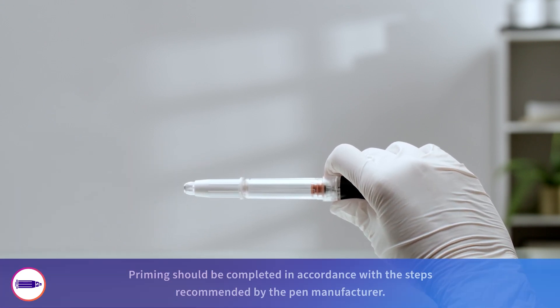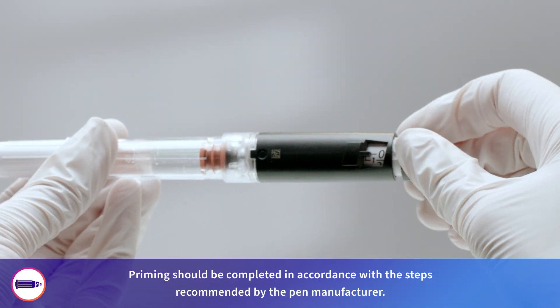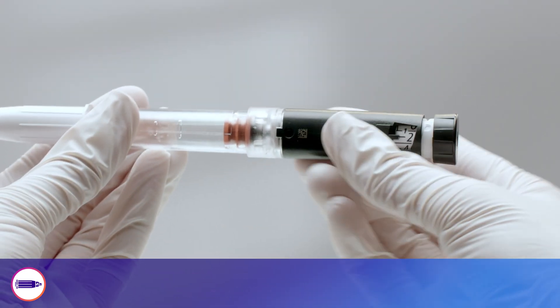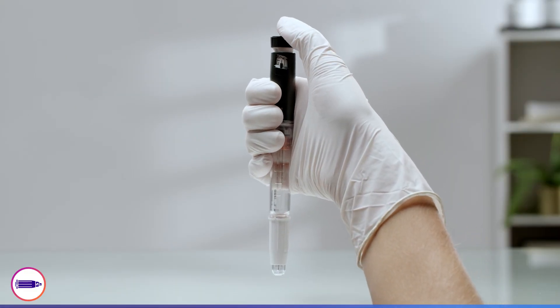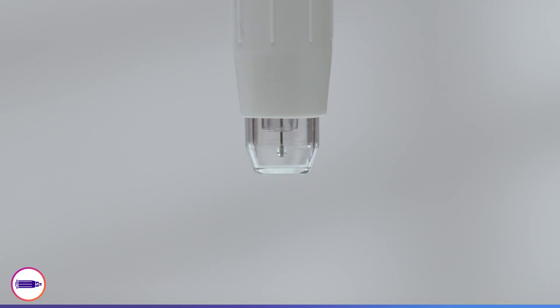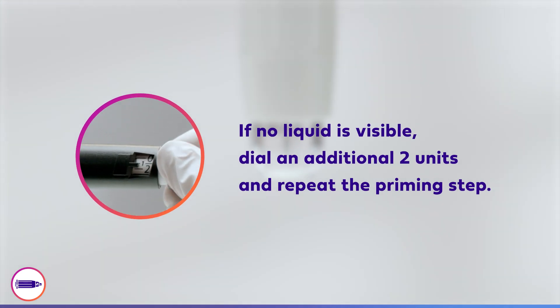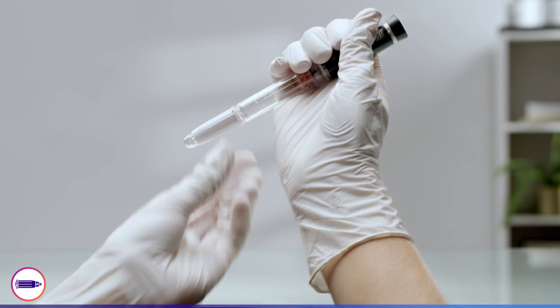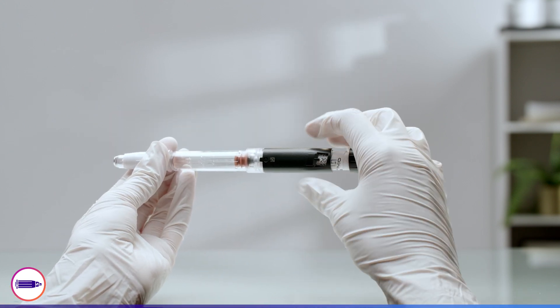Before delivering the injection, you must prime the pen to ensure the needle is open and working. For most pens, rotate the dial on the pen until two units is displayed in the dose window. Hold the pen in the palm of your hand and depress the dose button with your thumb. You should see a small drop of liquid at the needle tip. If no liquid is visible, dial an additional two units and repeat the priming step. Finally, dial the prescribed dose on the pen following the instructions of the pen manufacturer.